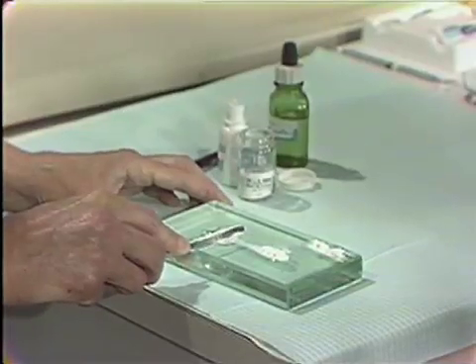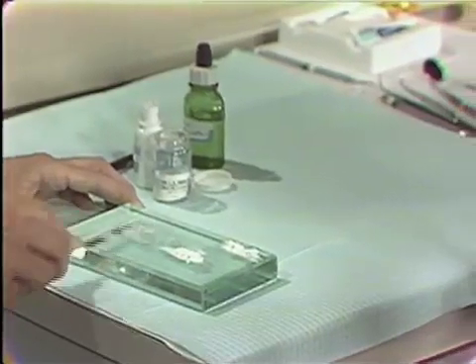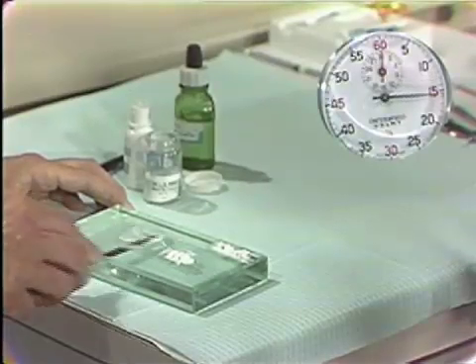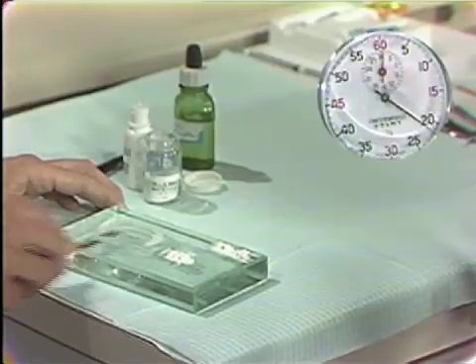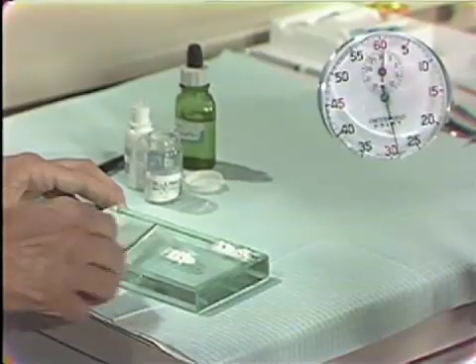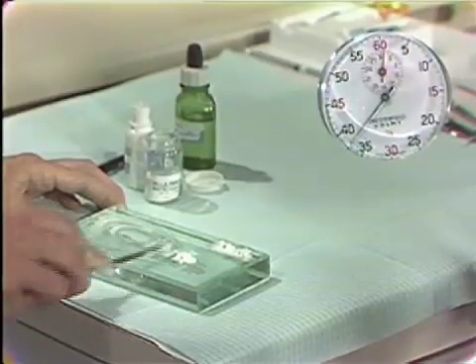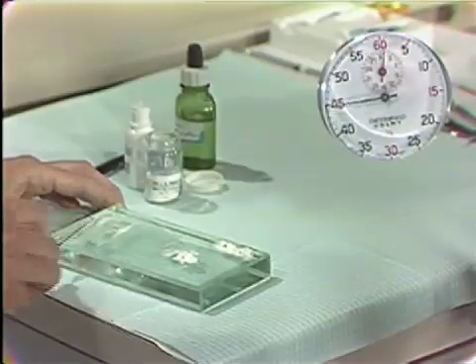Each of the increments of powder will be mixed for fifteen seconds. They will be mixed over a large area of the slab and with the flat of the spatula. Before the next increment of powder is drawn into the mix, notice the mix on the slab will be brought all up into one single mass — not left out over the slab — so that the powder will be put into this entire mass at once and then spatulated. Notice the flat of the spatula hitting all of it, and the constant bringing the material back and forth together so that you do not leave a lot all around the slab.